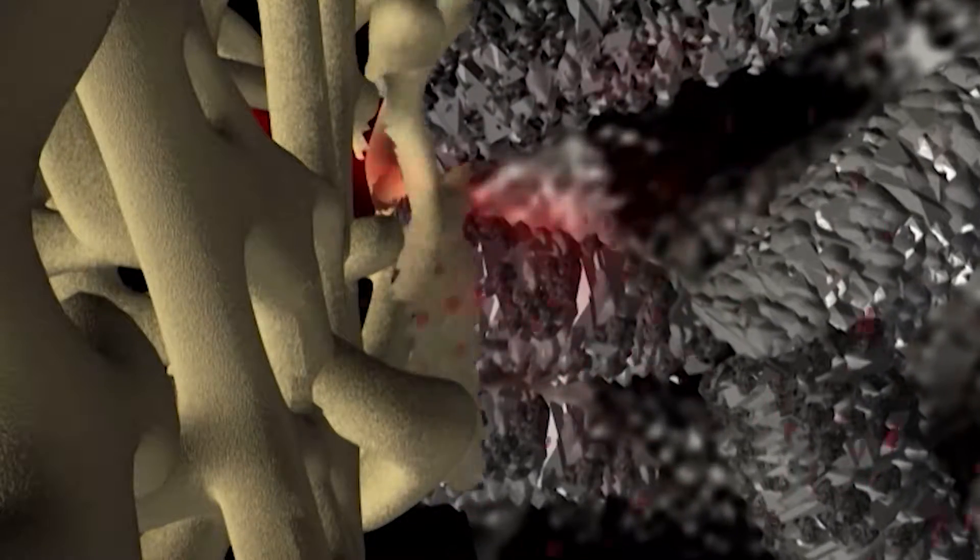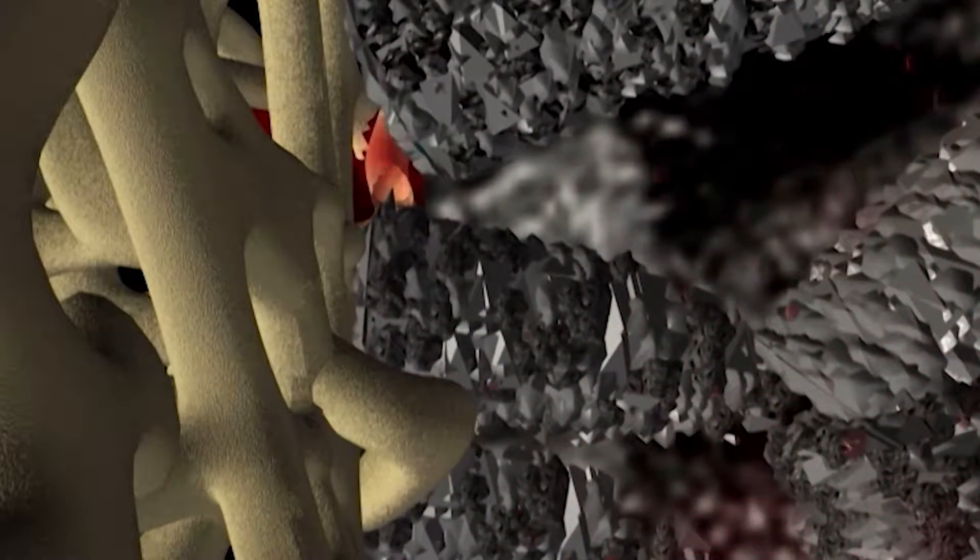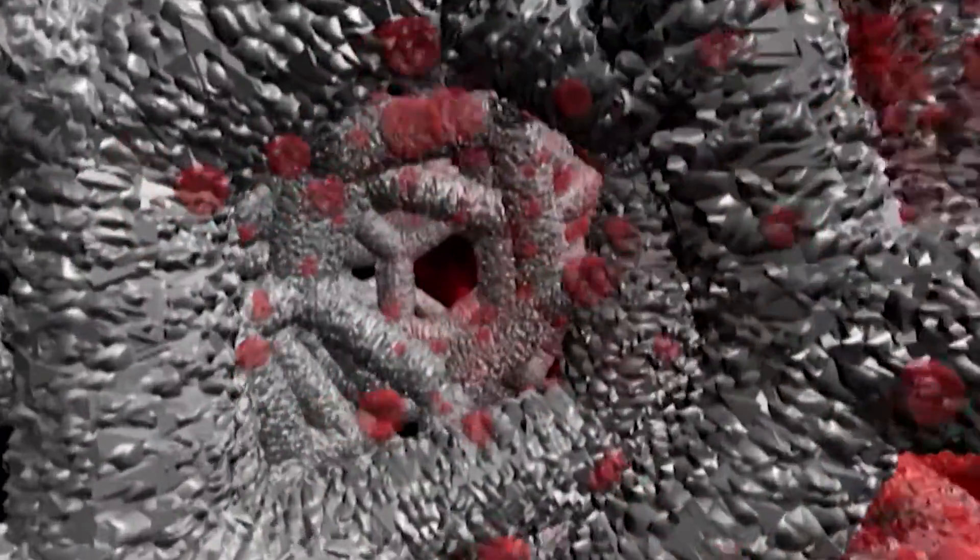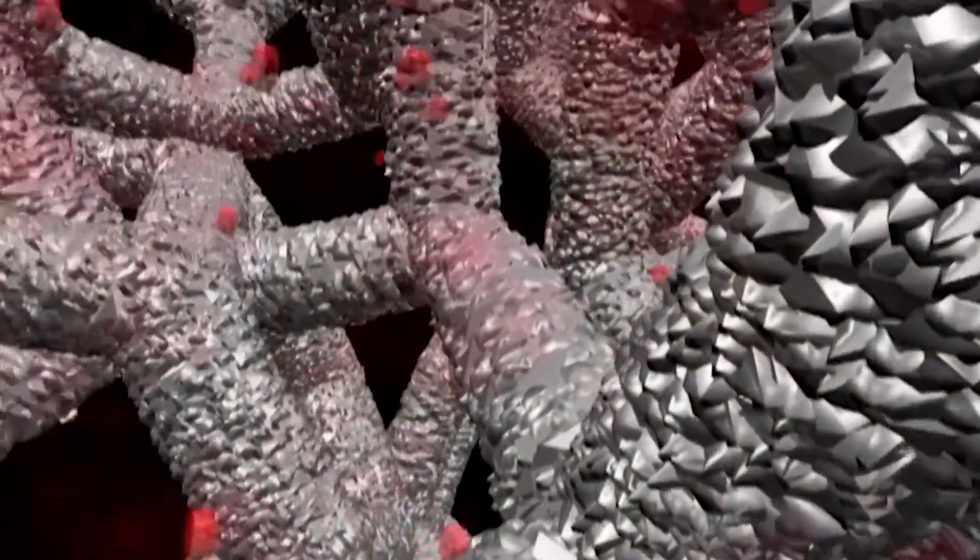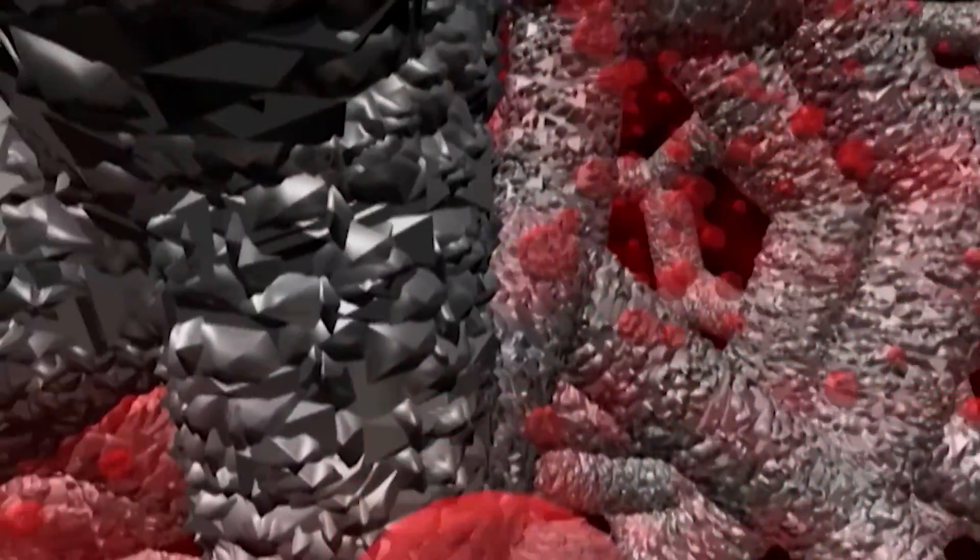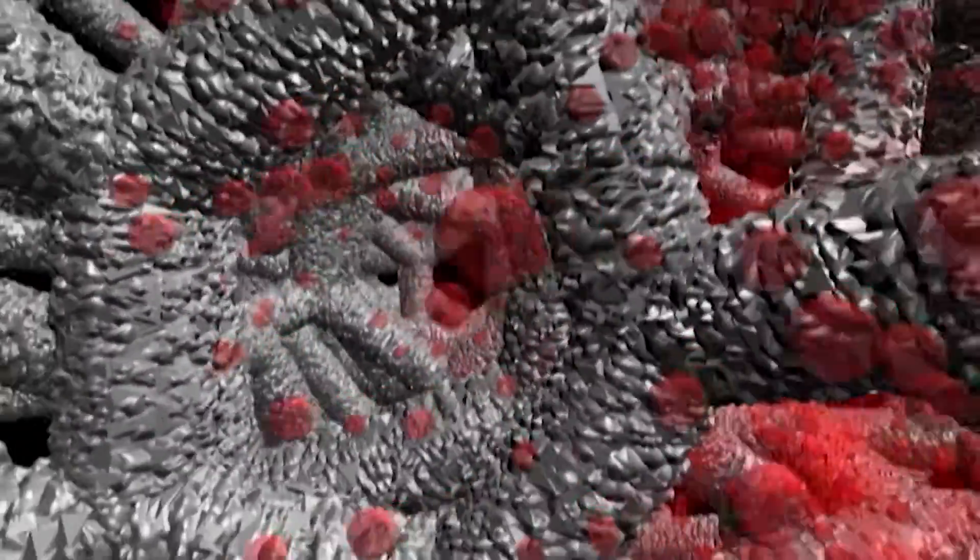The cancellous-like structure, high porosity, and chemically stable tantalum oxide layer that forms on the trabecular metal surface are all unique attributes that contribute to the osteoconductive properties of trabecular metal material, improving osseointegration, gap filling, and more normal bone formation.